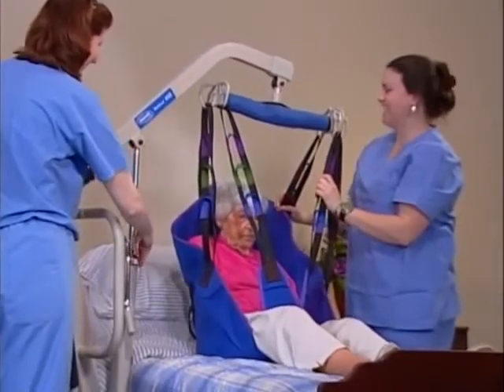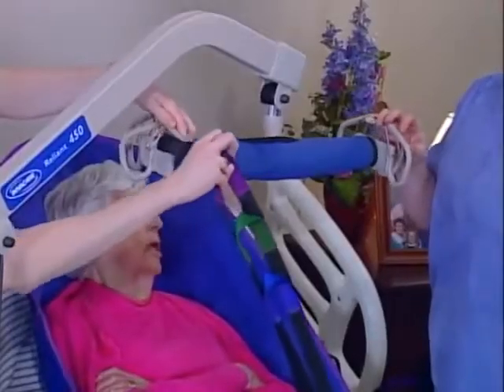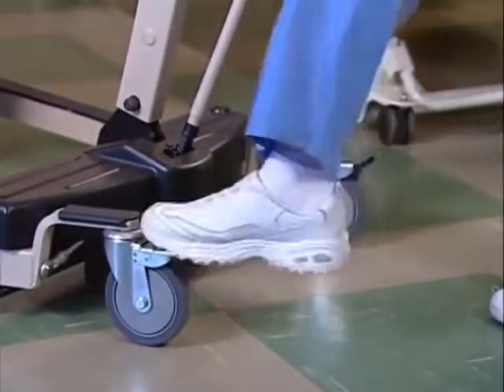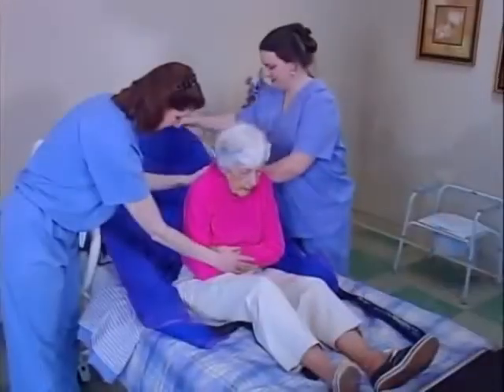Once the resident's full weight is on the bed, lock the lift's rear casters and unhook the sling from the swivel bar. Unlock the rear casters, remove the lift, remove the sling.